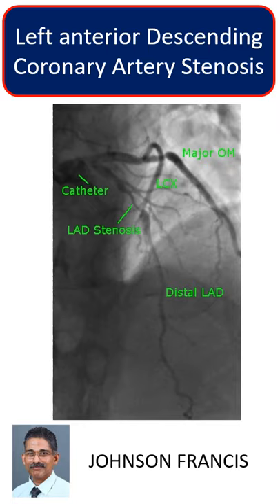Stenosis of the mid-segment of the left anterior descending coronary artery is seen on the AP cranial view, just after the diagonal branch. The distal LAD is relatively narrow, with mild ectasia just after the LAD stenosis. The proximal LAD also shows mild plaques.